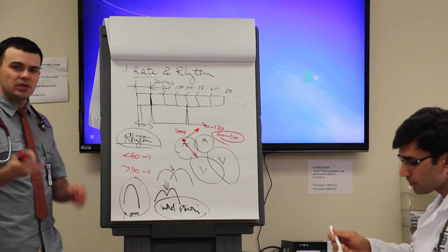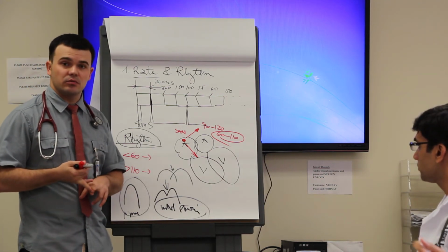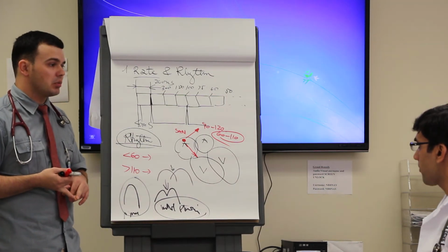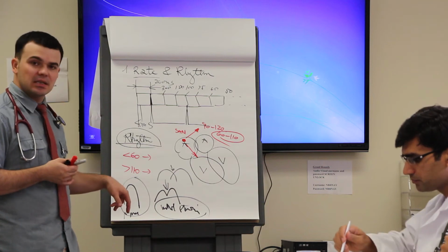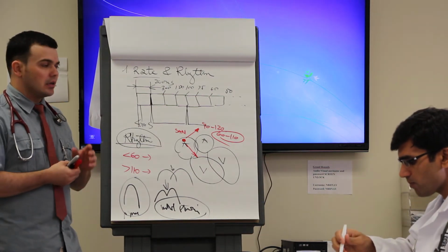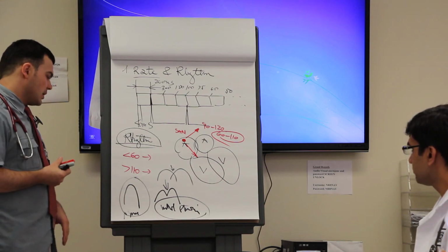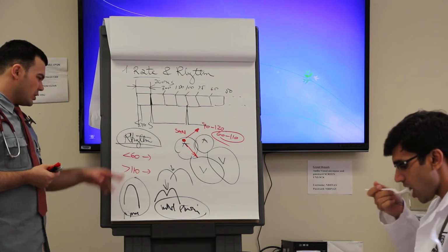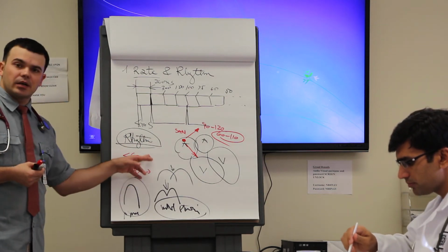So that means you're going to see tachycardia on EKG. The patient's going to be dyspneic, or not. You have old people with massive PE that were not dyspneic or desaturating. But you may be able to see these things on EKG: RVH, right axis deviation, and you may see right bundle branch block as well, along with cor pulmonale.